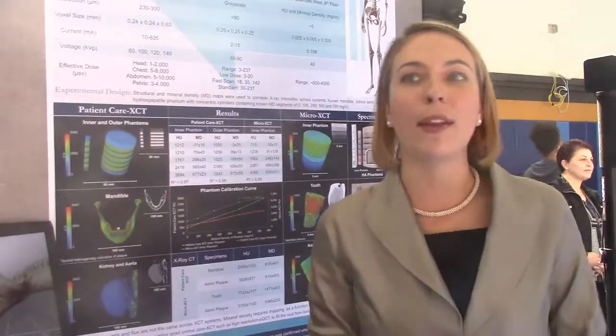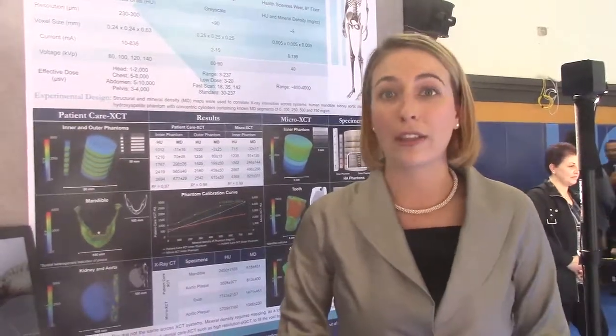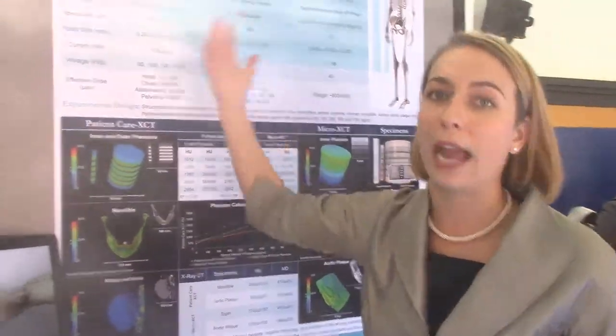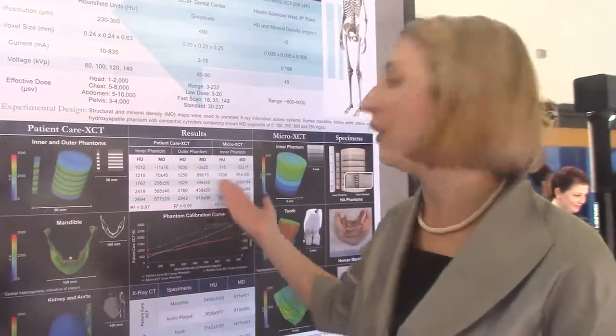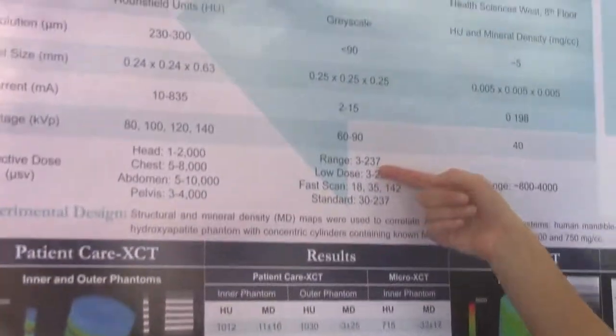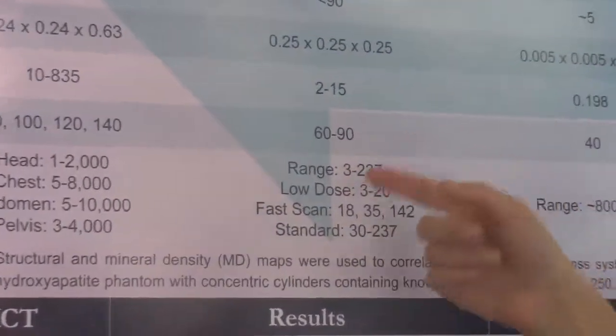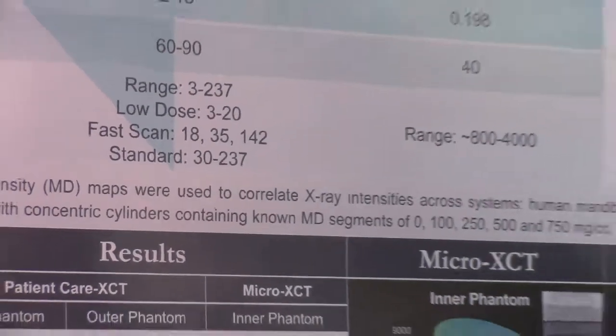So I want it to be fun and get students excited about radiology as well as research that's going on in this field, because this is the new known standard when you have any sort of disease that wants to be investigated: take a CT scan, go further. Also, we're hoping with this correction factor we determine we can do low range microsieverts, have less radiation exposure, and be able to have better resolving images for patients.